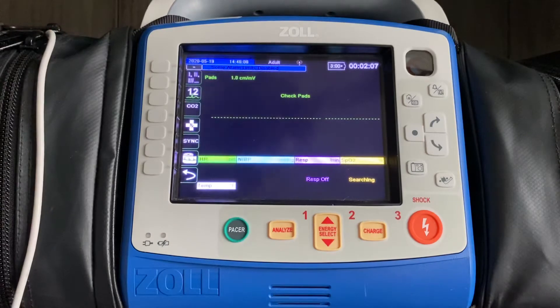The finger probe itself is important in the way that you place it. Ideally, you're going to place this on the patient's non-dominant ring finger. On most people, the non-dominant ring finger is going to be the finger that over the course of their life is the most protected, the least damaged, has the best capillaries, the best perfusion, and should in turn get you the most accurate readings.